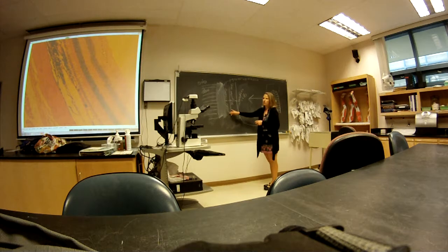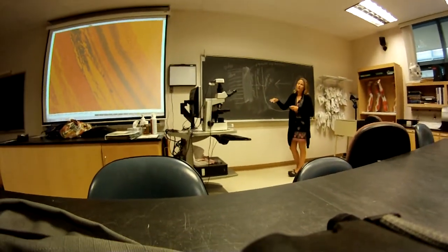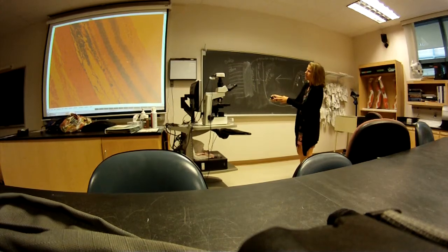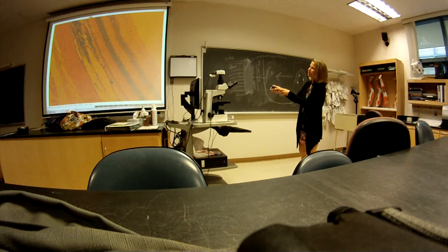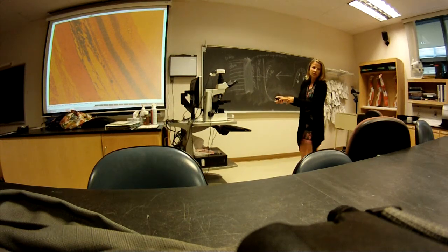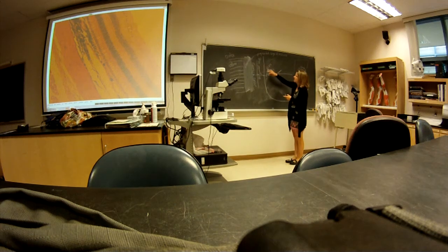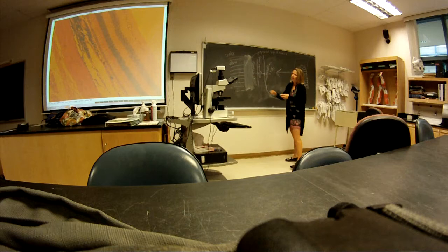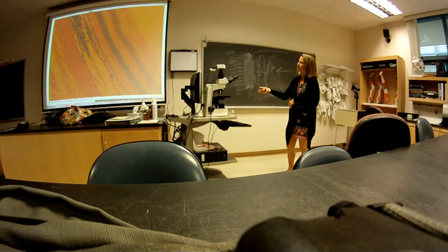So rods and cones are the outermost, then bipolar, and then ganglion cells. And the way to identify them easiest is to look for the nuclei, because they're connecting to one another. So where one ends in here and the other begins, it's hard to tell. So that's why I reference the nuclei. Okay, they show up well, and we know that belongs to those cells. So innermost is ganglion cells, bipolar cells next, and rods and cones next. That's the way to remember it. The scattering of the cells, those are the ganglion cells. That's another sign.